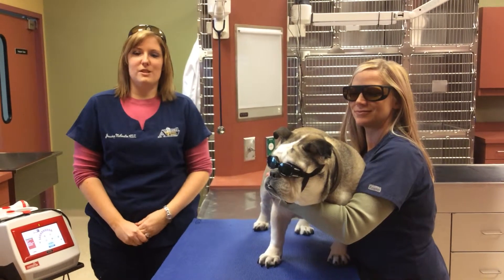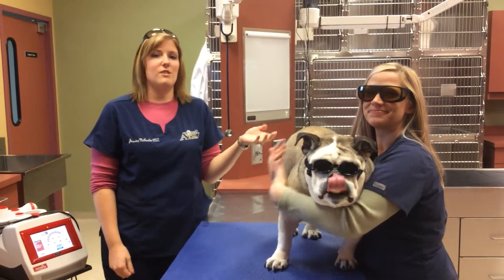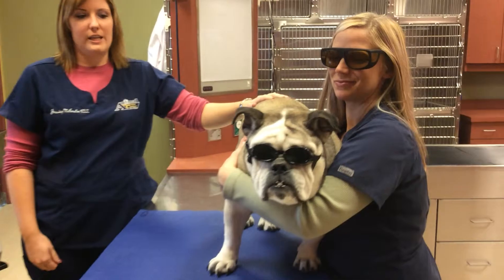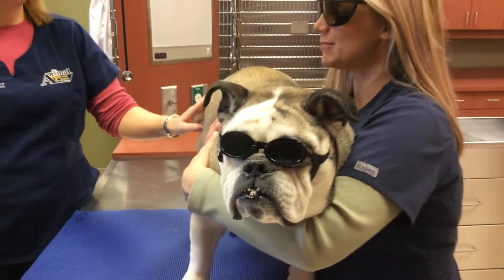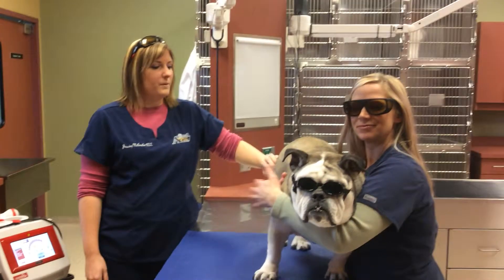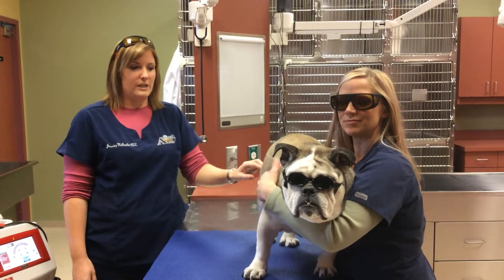Hi, my name is Jessica. I'm a certified technician at Animal Wellness Center at MoMe. This is Mandy — she's also a certified technician. And this is going to be our patient today, Smoochie. We're going to demonstrate how to use the Class 4 companion laser to treat her arthritis. The laser treats the arthritis by stimulating the cells to secrete substances that help with inflammation and pain.